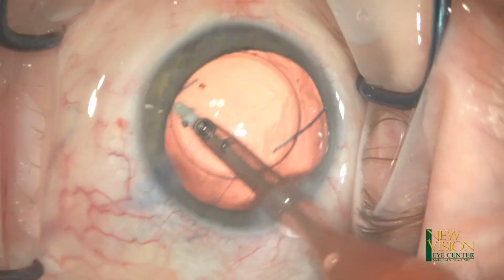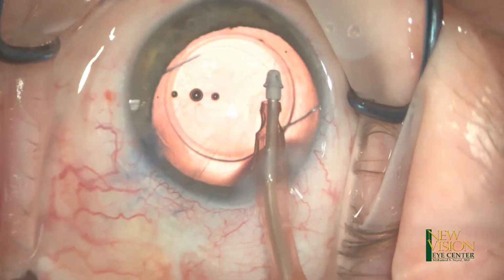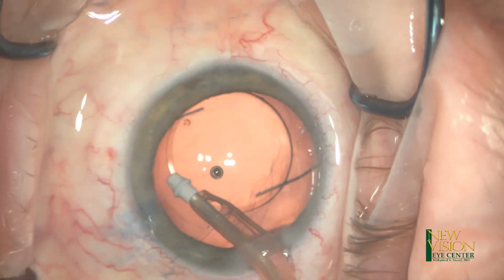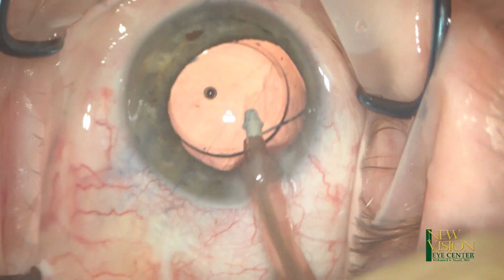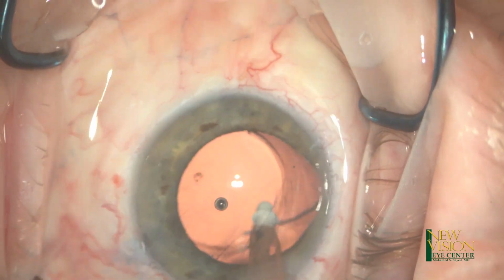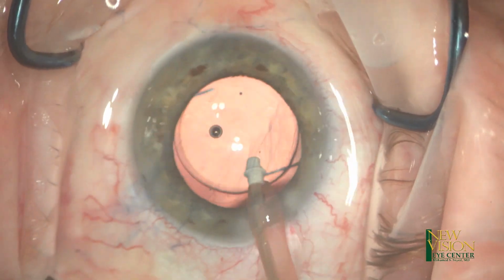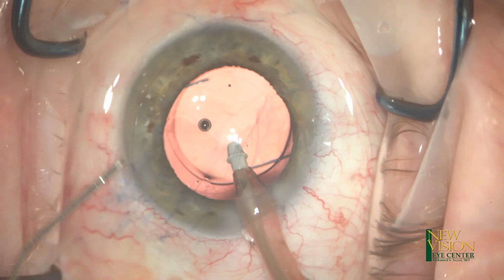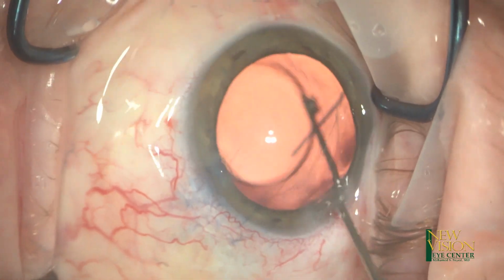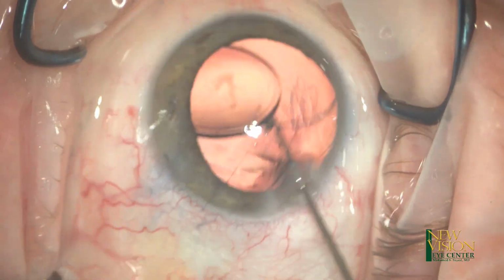So I was suspecting that one of the haptics is caught up, and here I was trying to find out if there was anything, trying to mechanically bring the pupil down. But trying to rotate the lens, it wouldn't really rotate, so the haptic must have been really stuck somewhere. So I injected more viscoelastic, and then with a Kuglen hook I rotate the lens. Yes, there was a haptic in the sulcus.